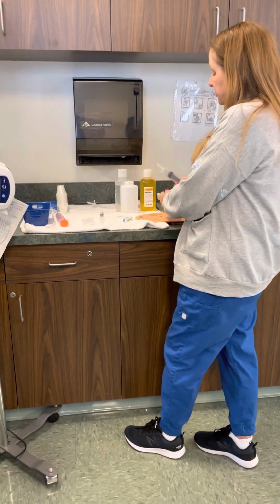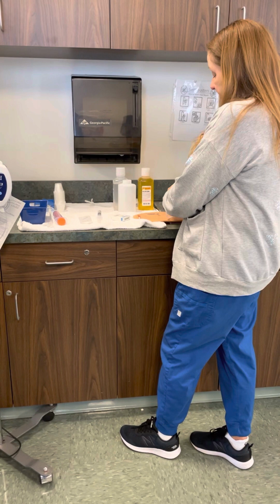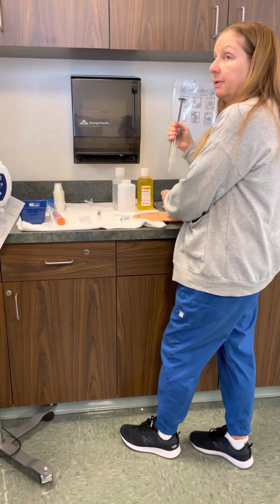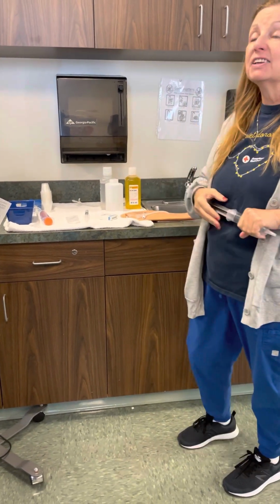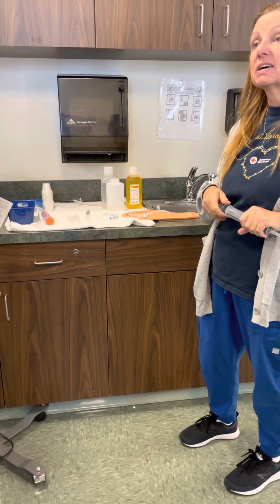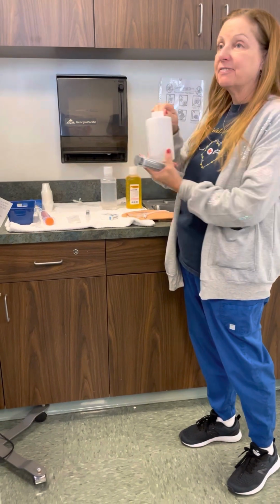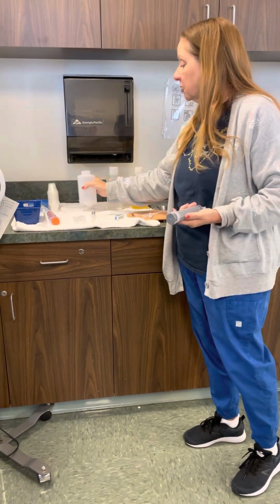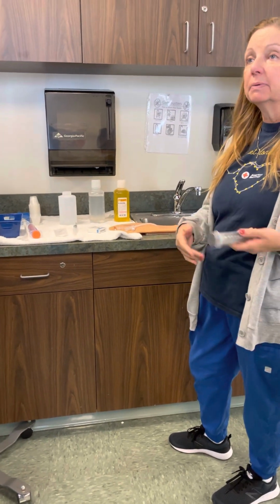To measure for the 500, you just keep pulling out, and you would put it in here and keep going to see how much is left in the stomach. I can tell you that if I'm getting 200 mLs, I will usually call the doctor, but the book says 500, which is a lot. That's like half of this. Half of this is 500. That's a lot. So sometimes just waiting 2 hours so the food can digest a little bit more might be helpful.